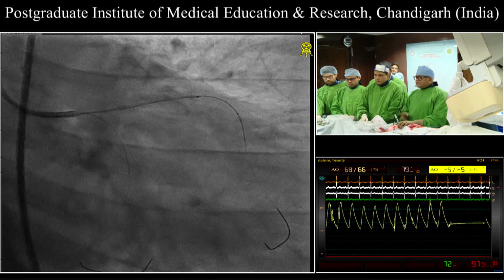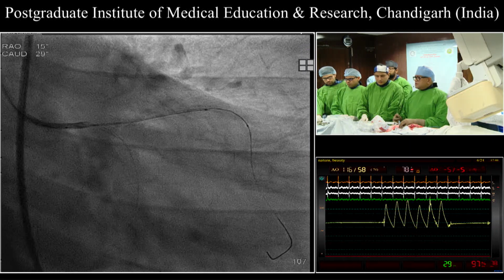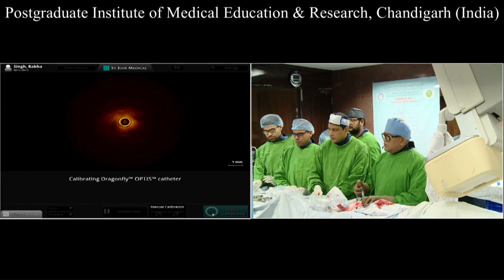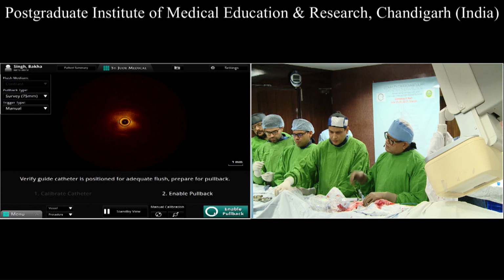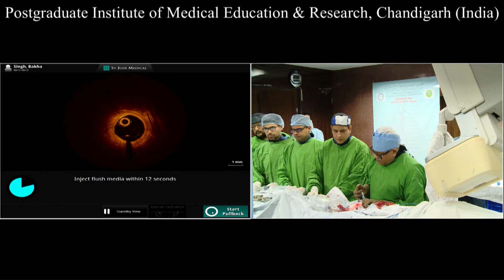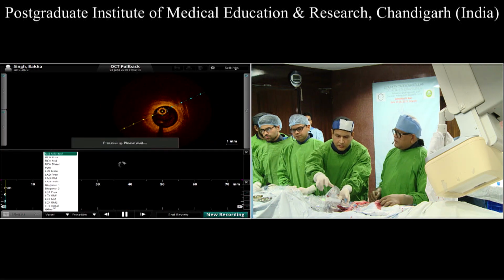Other questions, comments? One other comment: if you have an almost occlusive stenosis around the OCT catheter when you want to assess, for example here in the LAD, then it could facilitate the imaging to pre-dilate first, so have really good lesion preparation. Then you can evaluate the lesion preparation with the OCT and do it after the lesion preparation.